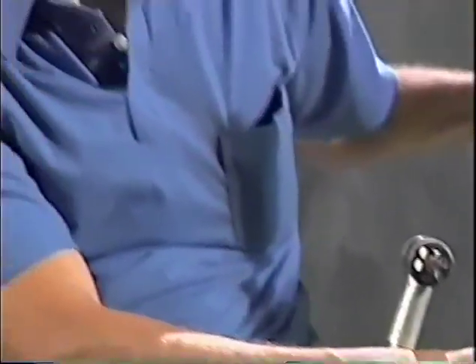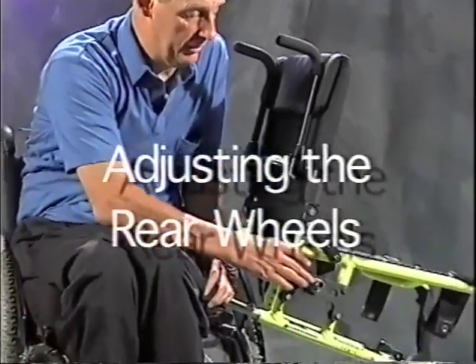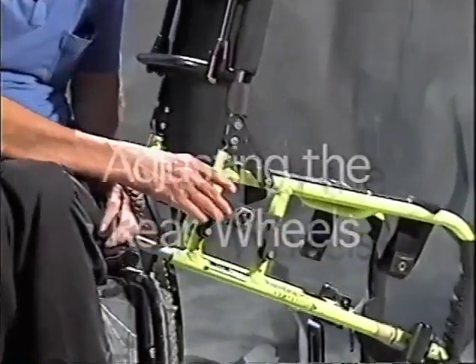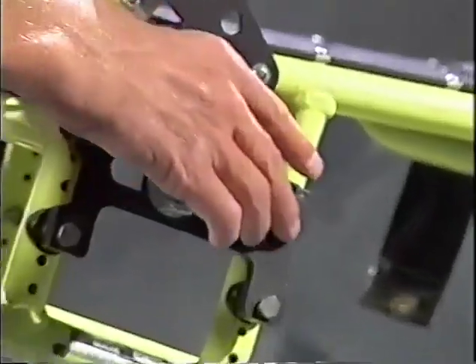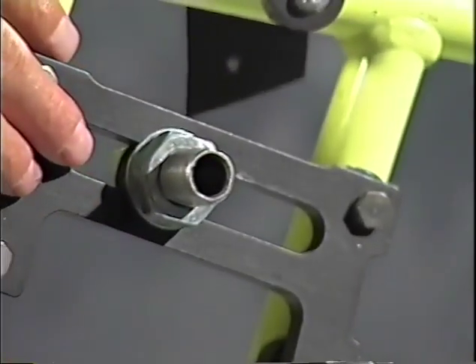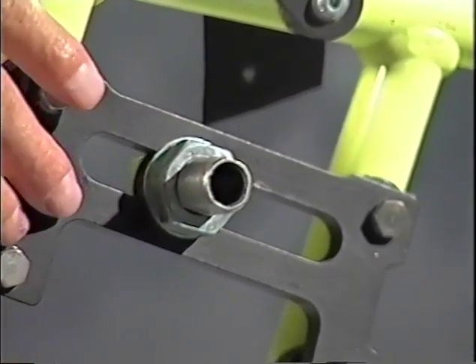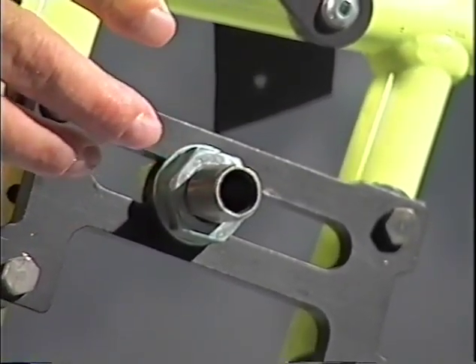So these things, the chairs are very adjustable, and get the right cushion, and you'll be in good stead to find out where you want to set the rest of the chair up. All right, you can adjust the rear wheel's position simply by loosening this bolt and sliding the wheel forward or backwards on the axle plate. Now what this will do is change the center of balance on the chair and how much of a stroke you get.